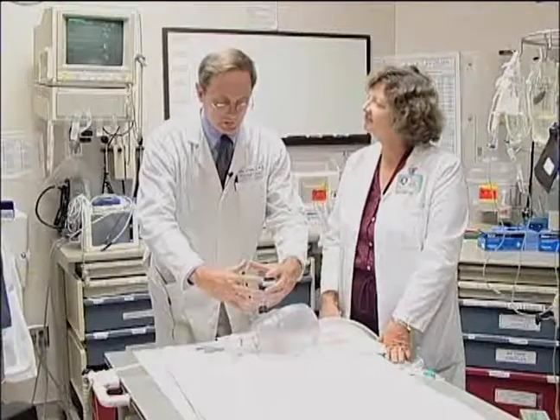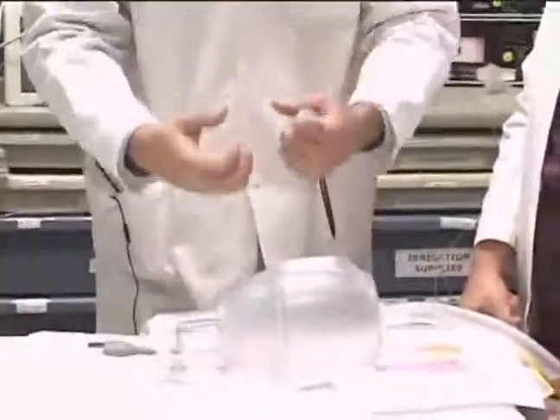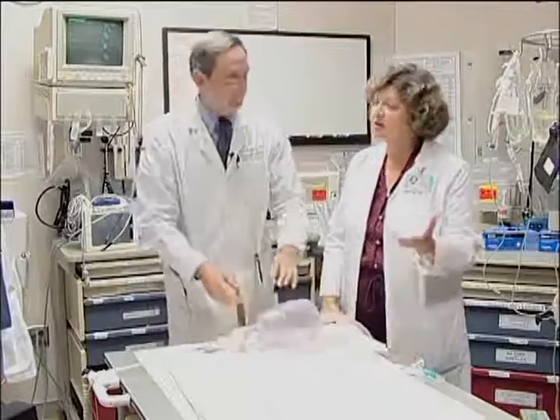And sometimes these patients have either very tiny faces because they're babies or very large faces, and we need just one person actually holding the mask to the patient's head, and then you would be assisting with the actual bagging. But one thing that you can really help us on is make sure we've got a good seal, because Doc 1 may not be listening for that, and we don't have a good seal here. We've got to get a better seal on this patient. And sometimes it's hard because we're trying not to disrupt the C-spine precautions, and these patients, they're not like every other patient. We're trying to take care of the C-spine.